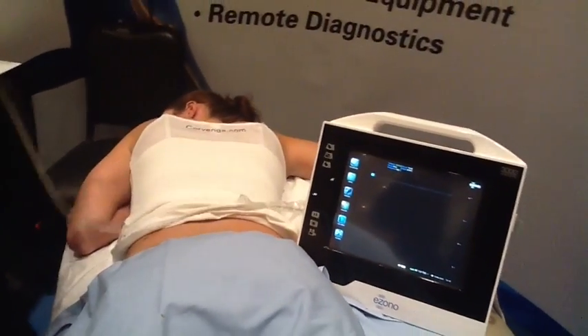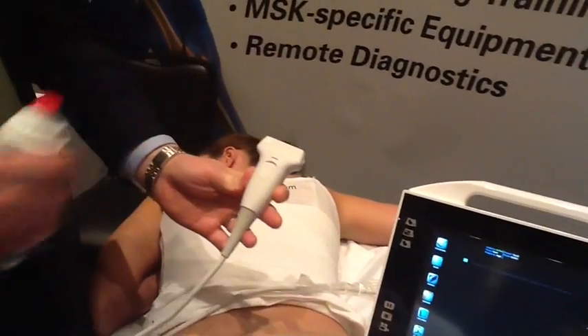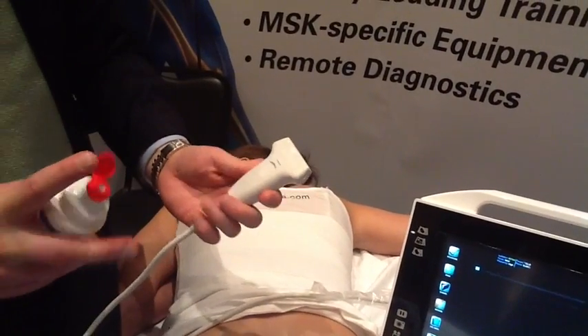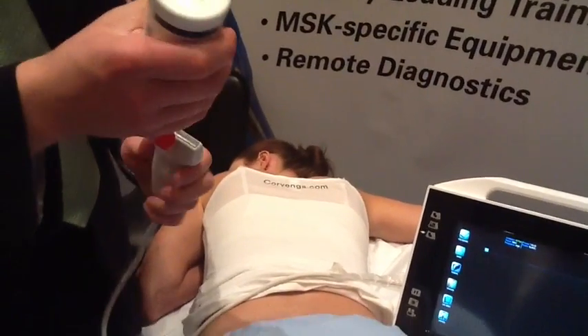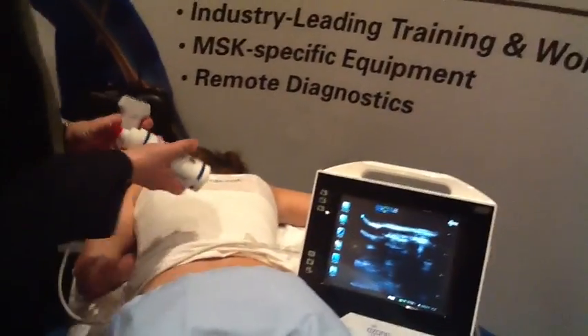I'm going to show you what the image is going to look like. I'm using a high-frequency linear probe. Frequencies go around 5 to 15, which gives me the depth I need to see an SI joint on either a large person or a smaller person.